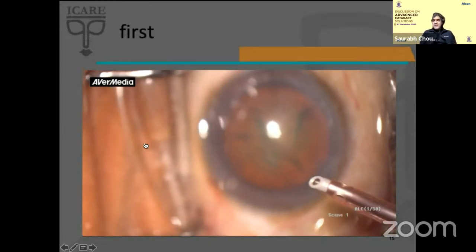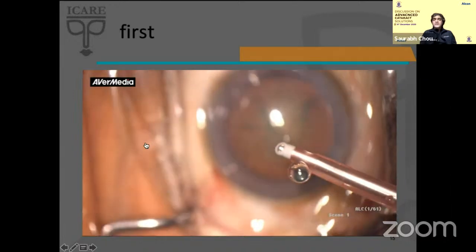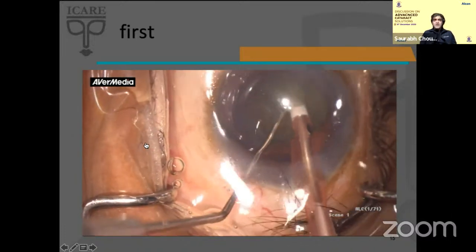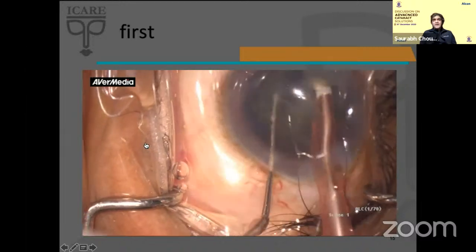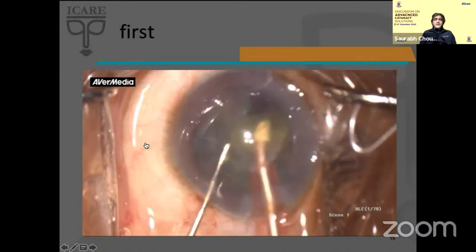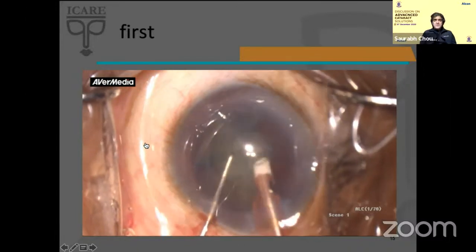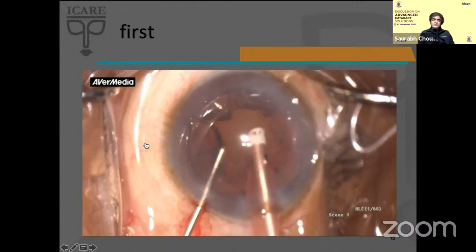So this is one of my first cases which I did perform here. I'm just trying to show the tip here. It is nothing different from what the tip was, except for the polymer, and you can actually see the metallic tip inside there. I am going to perform a surgery, and this is one of my first few cases, and I'm performing my direct chop here, and this is in real time, and I am going ahead and chopping the case. And you can see the followability is very good. The chamber stability is as it was with the balance tip, and we're very sure about the chamber stability with the Centurion vision system. And as you can see, the followability, and it wasn't a very hard case, and we could actually go ahead and just finish off the case.